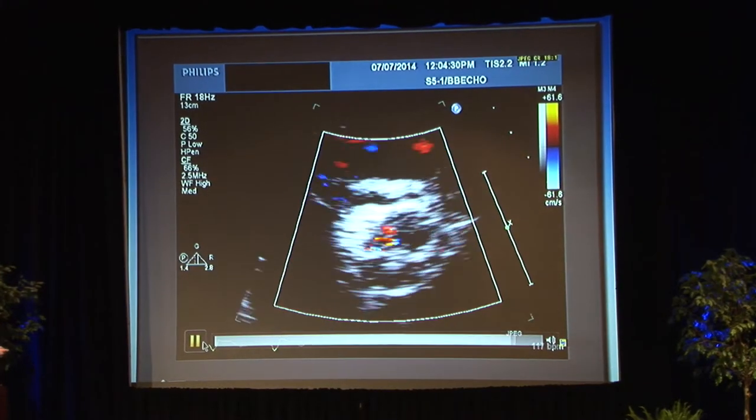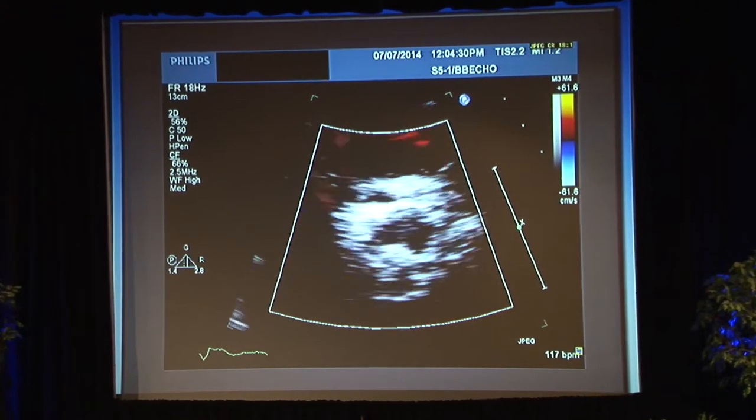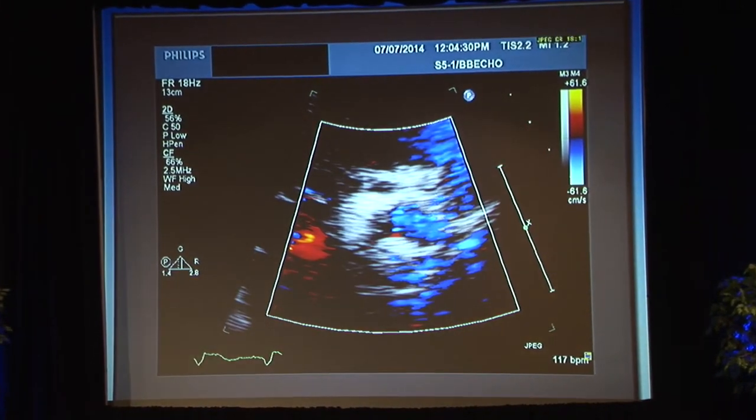Here's a 92-year-old patient. Has a big chunk of calcium right in the annulus. So his annulus is oval-shaped and there's this rock here. If we look at that rock, it actually extends down into the LV outflow tract. He has a little AI in the end, but I want to show you the valve also, which afterwards, from the transthoracic echo, the valve itself, which should be round, is a little deformed here from that chunk of calcium. But with that, he ends up with mild AI after the case.